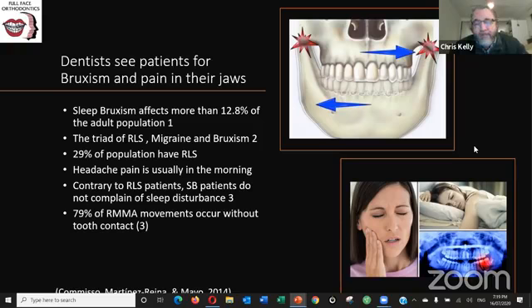So it's terribly important to know that that's the case. However, whilst it's totally possible to see that in other types of sleep tests that don't have audio and visual, you're going to pick up so much more when you're using facial electrodes instead of leg electrodes.